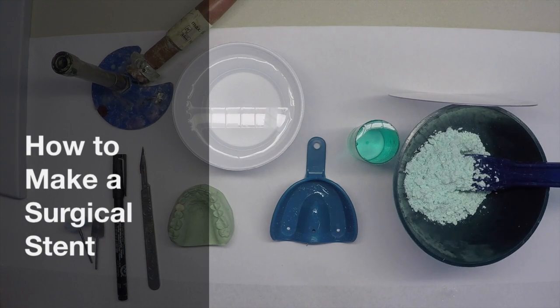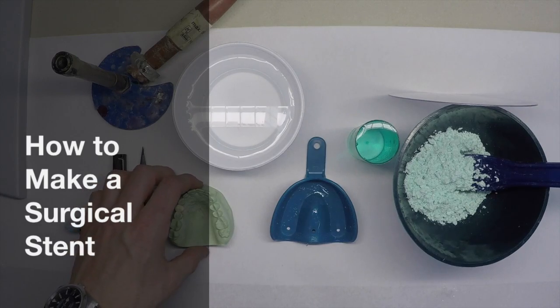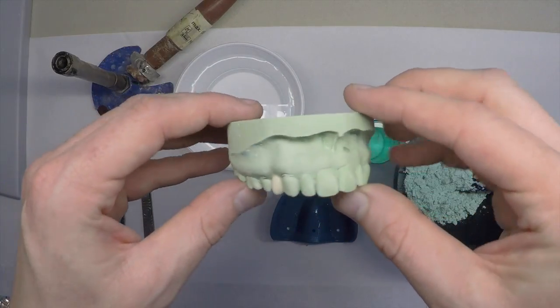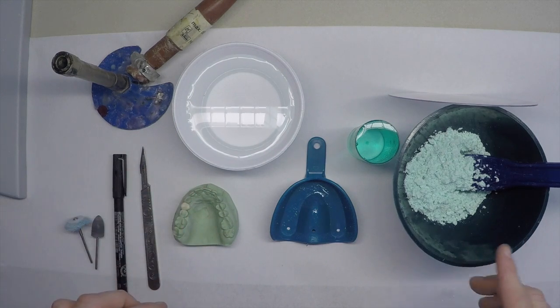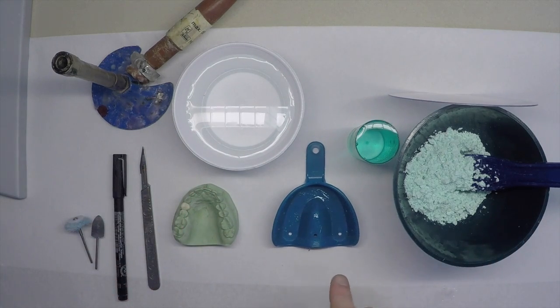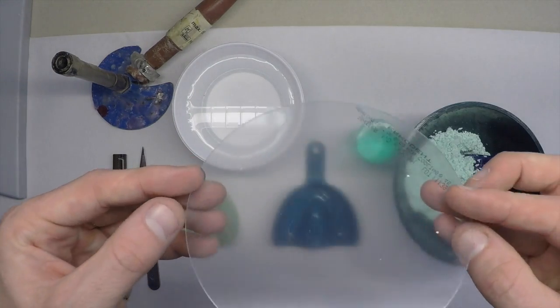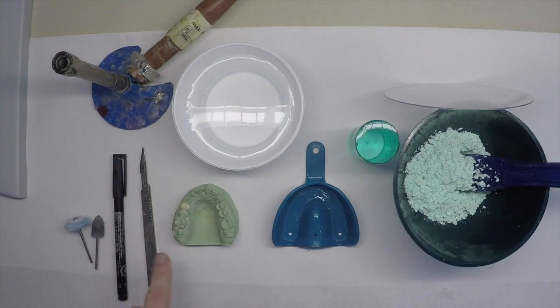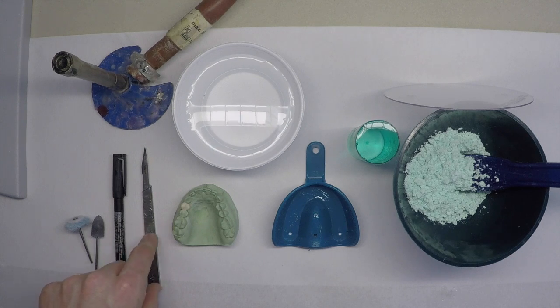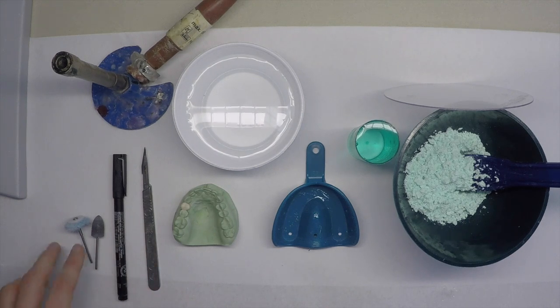What we need to make a surgical stent is our diagnostic wax up, some alginate, a tray with some adhesive, a 1mm Essex retainer blank, some slurry water, a metal handle number 11 scalpel, a pen, some polishing burrs and a flame.